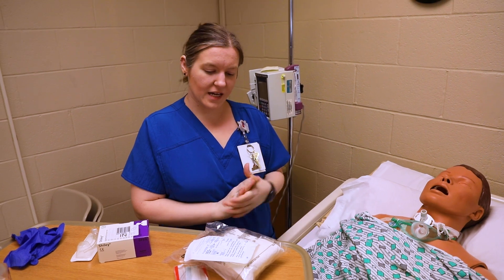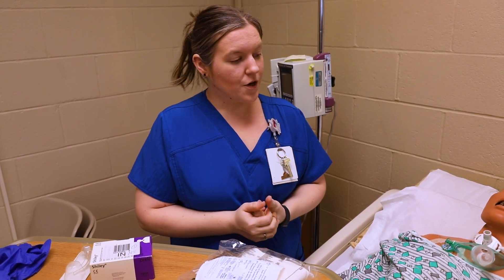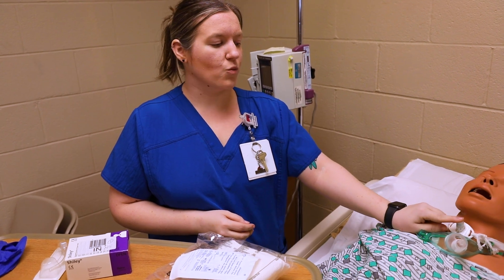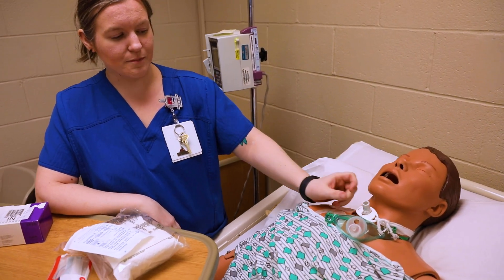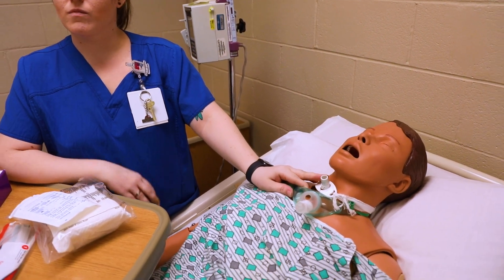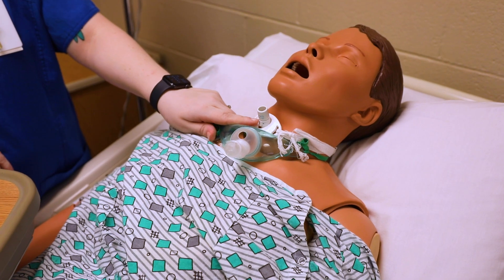I'm going to show you how to do trach care on this patient. Trach, or tracheostomy care — one of the first things you need to know is what kind of trach they have. This mannequin has a reusable one; there are also disposable ones.